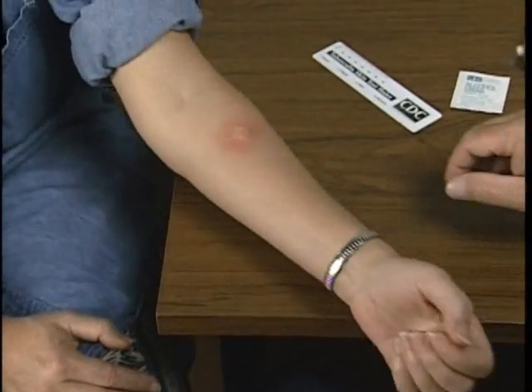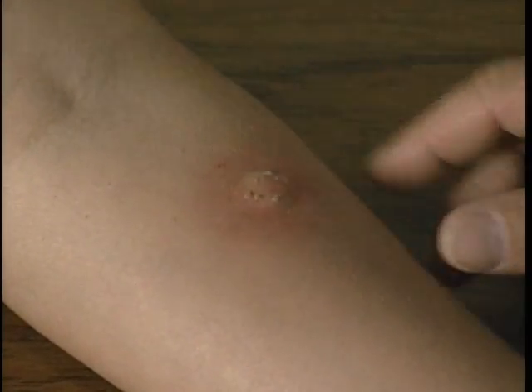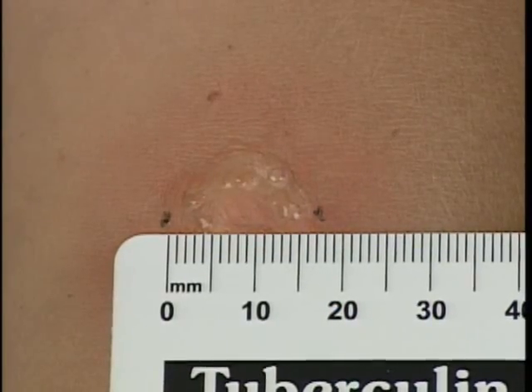Reactions to the skin test will vary. For example, this is a very large reaction with blistering, swelling, and redness. Make sure to record blistering even if no induration is present. Palpate this induration gently, as it may be painful. Measure only the induration. This reaction measures 17 millimeters.